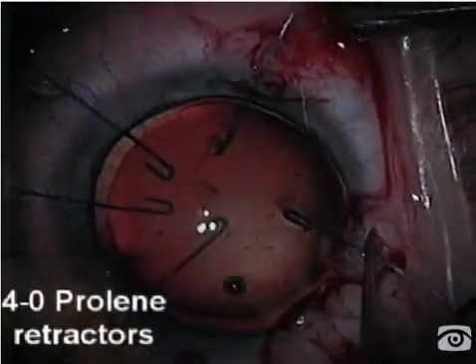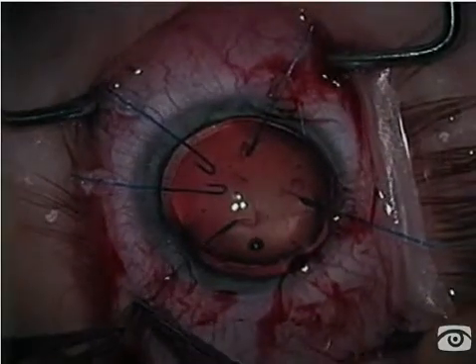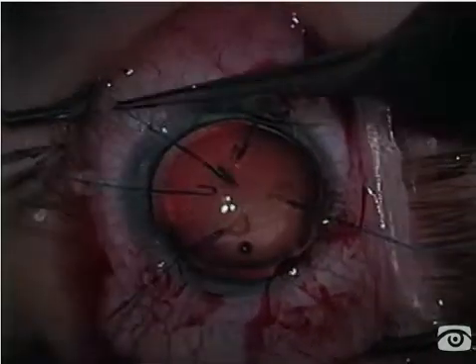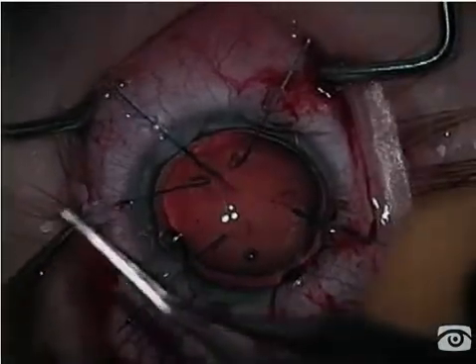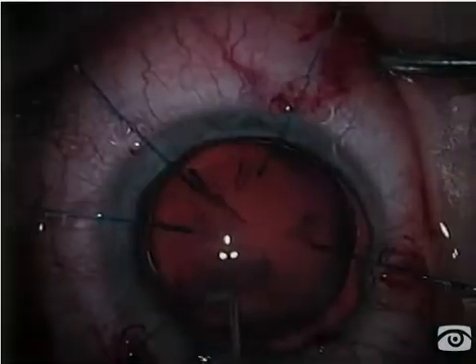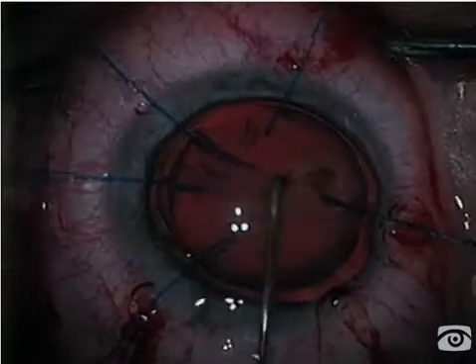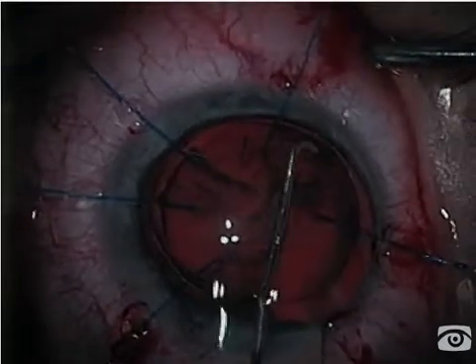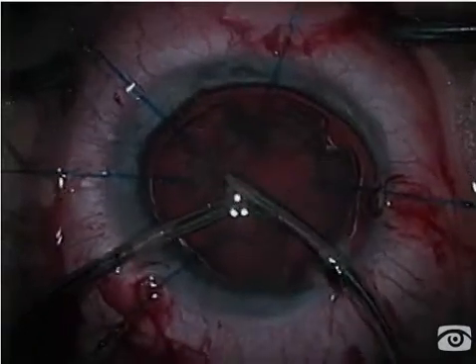Having done this, I'm using 4-0 prolene iris retractors, only hooking the capsulorexis edge to give me support, basically replacing the support that a normal zonular ring would afford. After hydrodissection, I'll be able to aspirate this lens using bimanual IA instrumentation through the paracentesis sites.